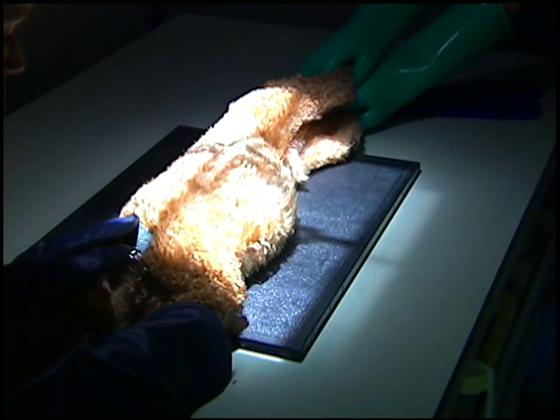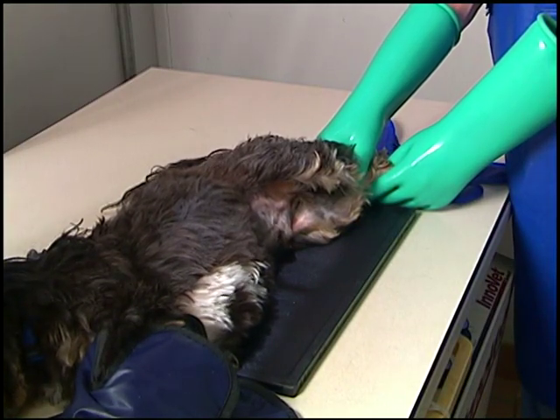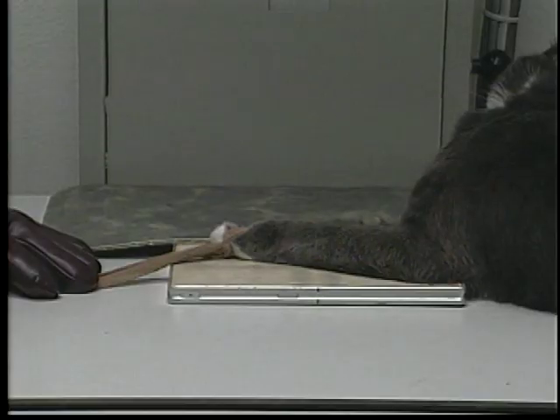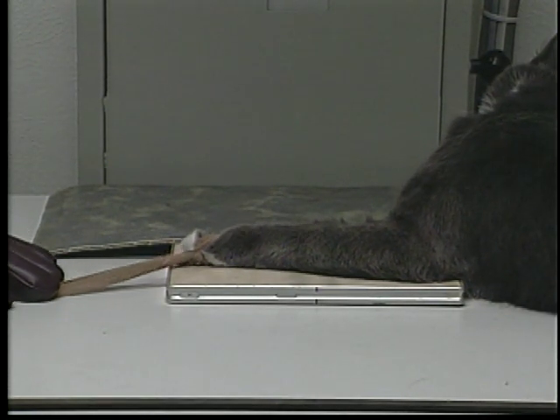Having the lungs full of air will increase the contrast and make chest films much easier to read. When radiographing the abdomen or skeleton, the exposure should be on expiration. The pause between breaths will produce less motion and a better image. Another helpful hint when X-raying legs and paws is to extend the leg with a thin rope or gauze, thus keeping your hands out of the beam.